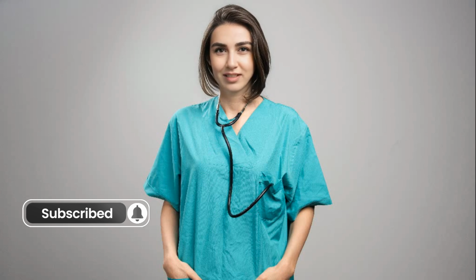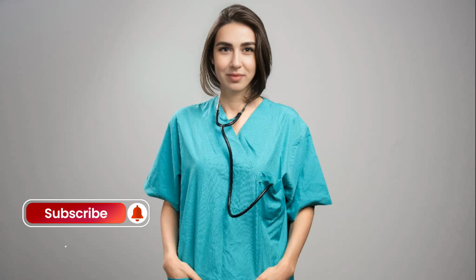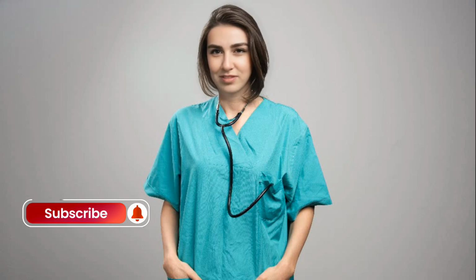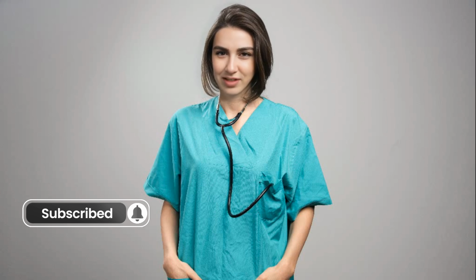Reducing the risks of angioplasty. Pre-procedure screening. Patients are thoroughly screened for risk factors, such as allergies to contrast dye or kidney function issues, to minimize complications. Medications. Blood thinners are typically given before and after angioplasty to prevent clot formation. Skilled team. Having an experienced cardiologist and support team in a well-equipped cath lab can significantly reduce risks. Follow-up and lifestyle changes. Patients are advised to follow lifestyle modifications, e.g., diet, exercise, and medication regimens to maintain artery health and reduce the chance of restenosis.